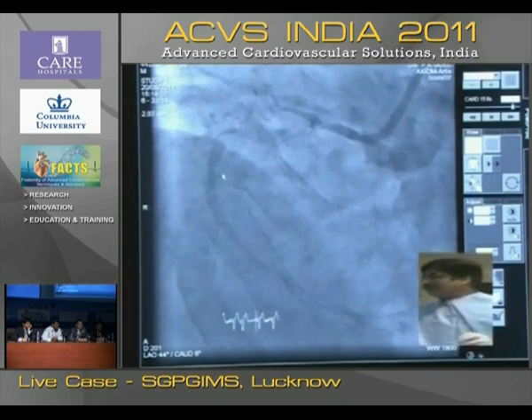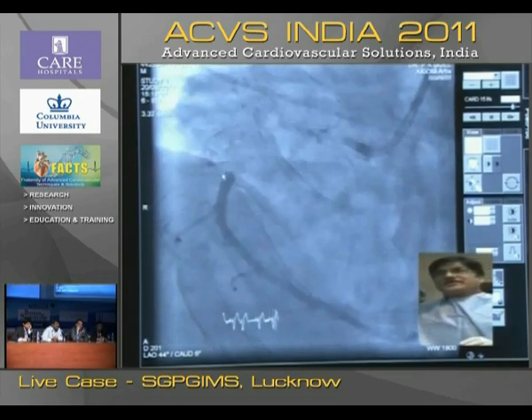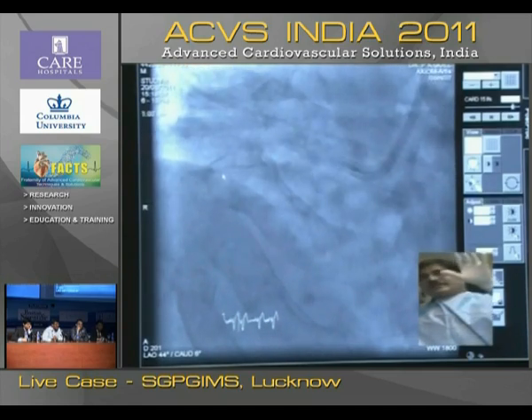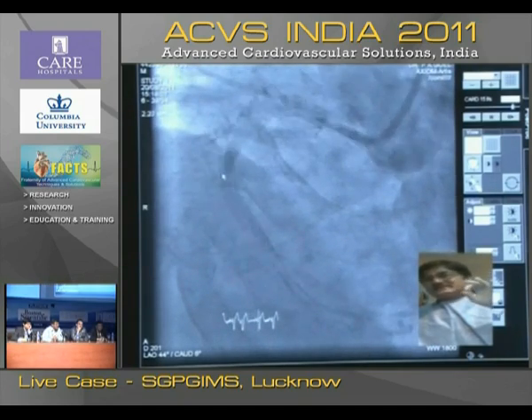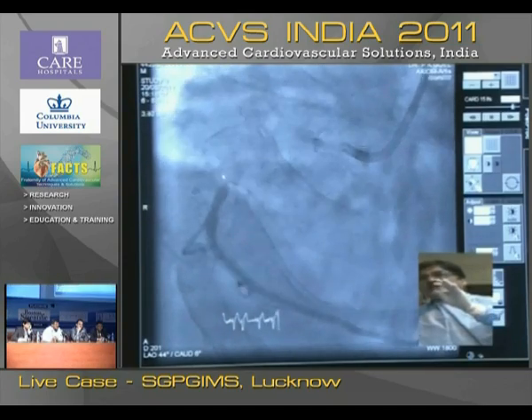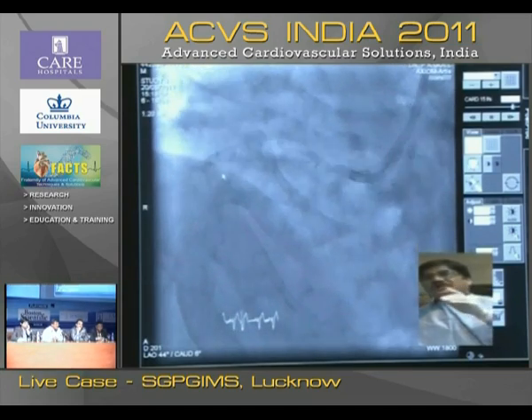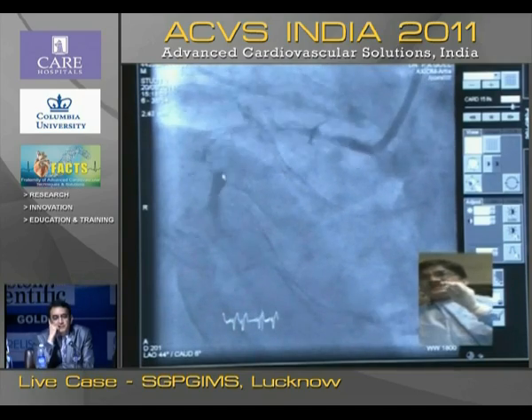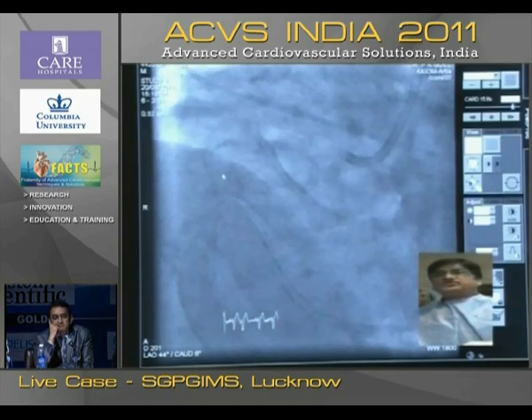Yeah, you can go ahead with the case. So now you see, are you with me? Yeah, we are with you. So as I told you, there are heavy bridging collaterals, so that says that probably there is chronicity there, true. But one good thing which I can see in this patient, I think the angiogram has to be very well assessed for CTOs. At the point where the lesion starts, I feel there is a small nipple there. Yep, correct. So maybe a wire will go into that.